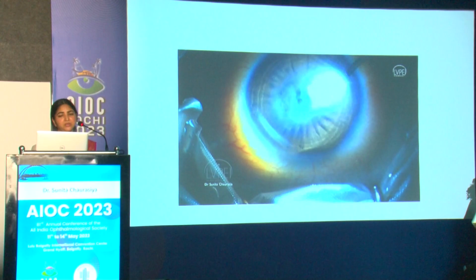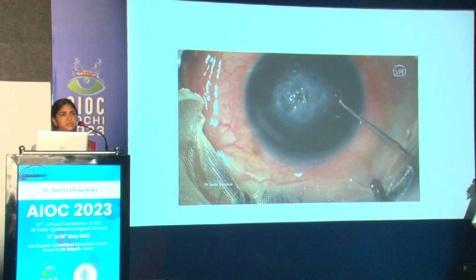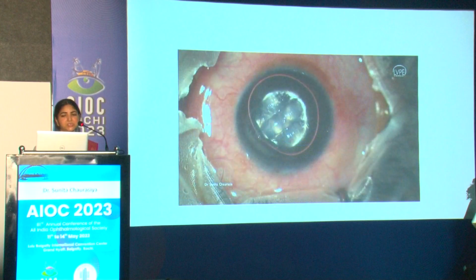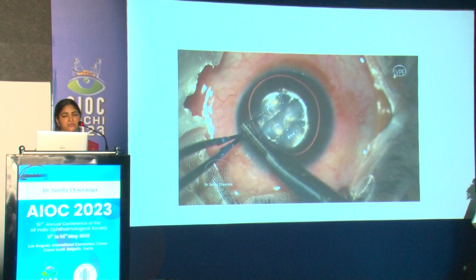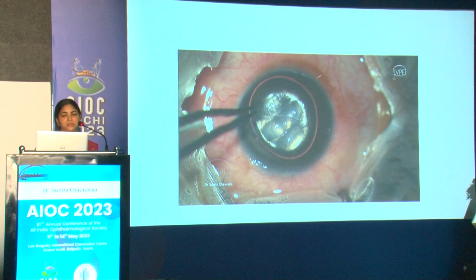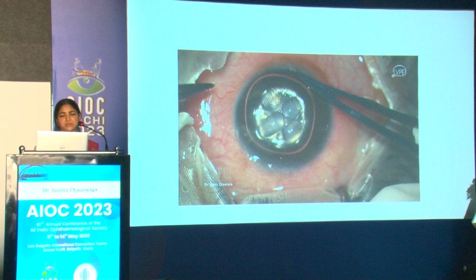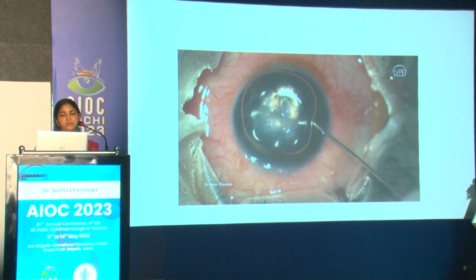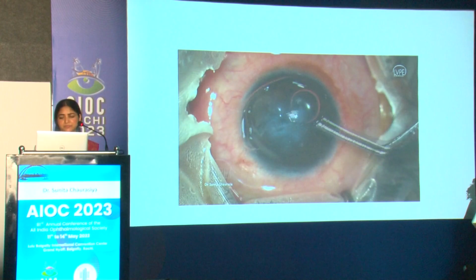One more case, where it was not responding because there were multiple loculi. Though the area looks smaller, this patient took a lot of time because there were multiple defects in the central part of the cornea. This could be seen with the light pipe very easily, and subsequently an infinity suture was taken. The sutures are passed through the stromal part of the cornea in the periphery, and they are like an overlay in the center. So you don't actually pass through the stroma in the central visual axis, to minimize the scarring which can occur as a consequence. Once the edema resolves and we are happy with the posterior membrane healing, we will remove these sutures early. Again, we can see remarkable resolution right on the table itself.